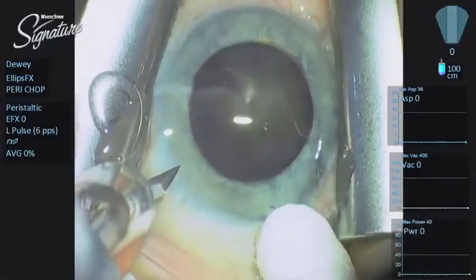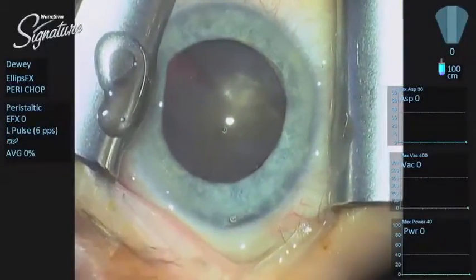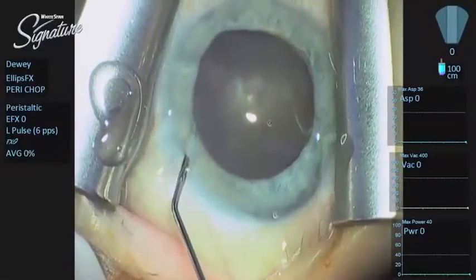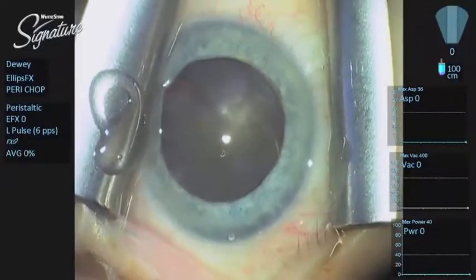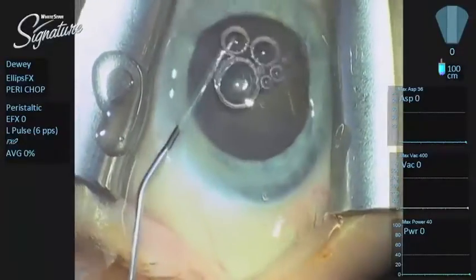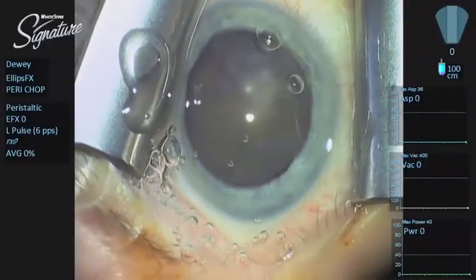One of the little tricks I have is back when I was using the Duet system, I learned that you use a side port incision made with an MVR blade. We're putting in some intracameral dilation that includes intracameral lidocaine, and then we're going to fill the anterior chamber with Endocoat. What we're trying to do is get a pretty reasonable fill, but not overfill.